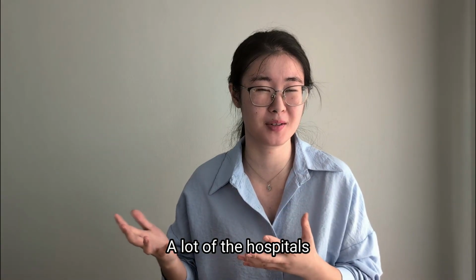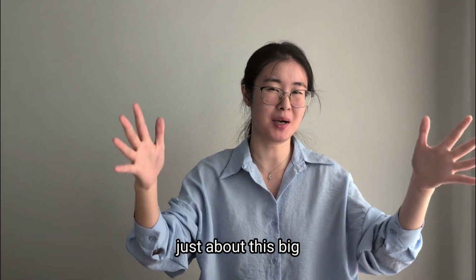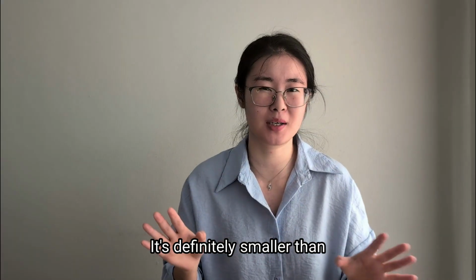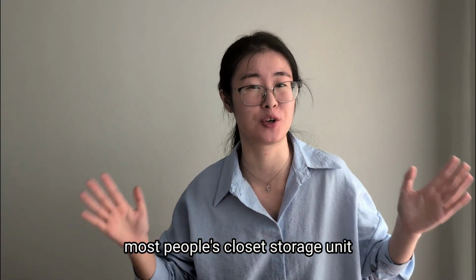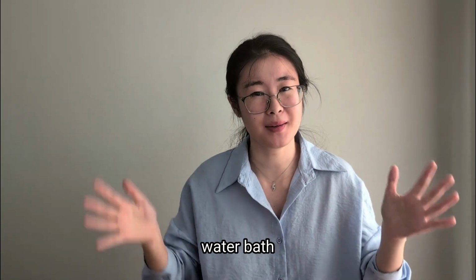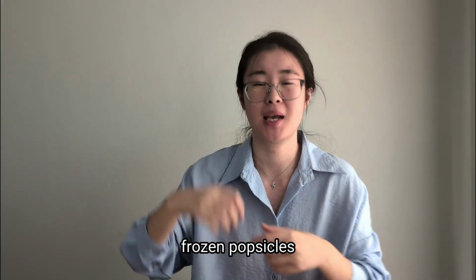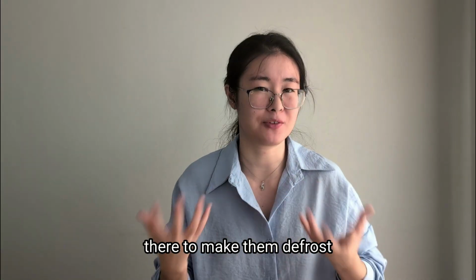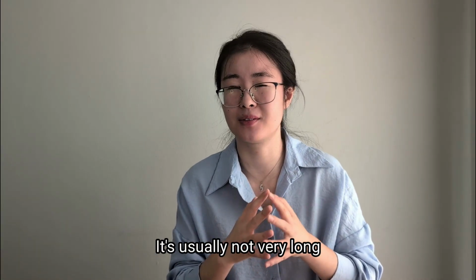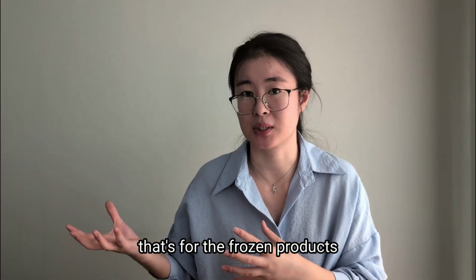In a lot of hospitals, our defrosting unit is like a water tank just about this big. It's definitely smaller than most people's closet storage unit. But within that tiny little water bath, we need to throw in those huge frozen popsicles and shake them in there to make them defrost. It's usually not very long, but 10 to 20 minutes at bare minimum. That's for the frozen products.